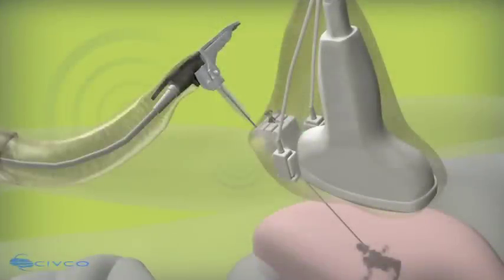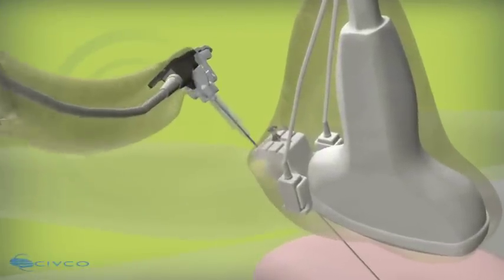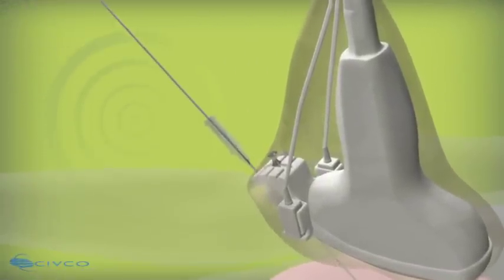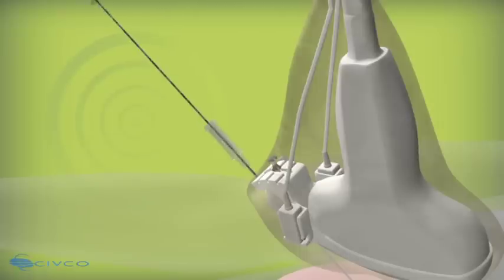After reaching desired target, rotate the needle out of the sheath hub by turning counterclockwise, leaving the sheath in place. Treatment is ready to begin.